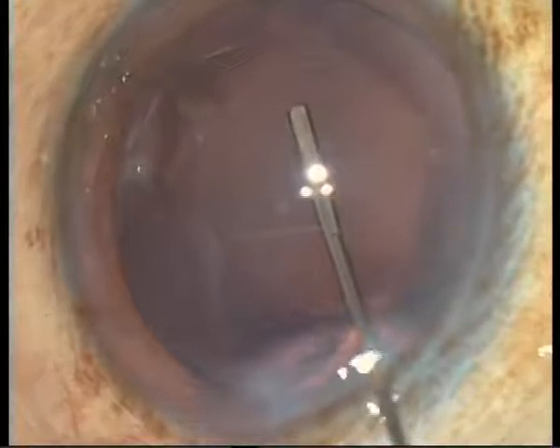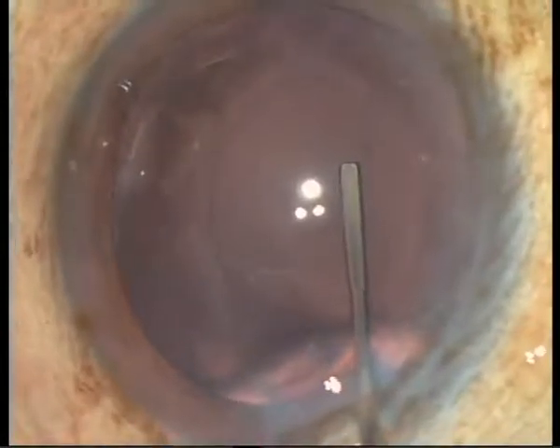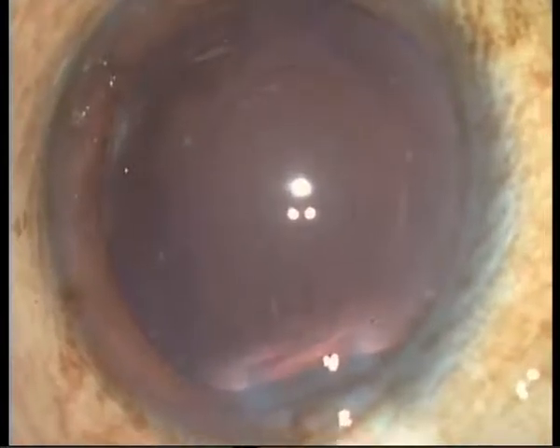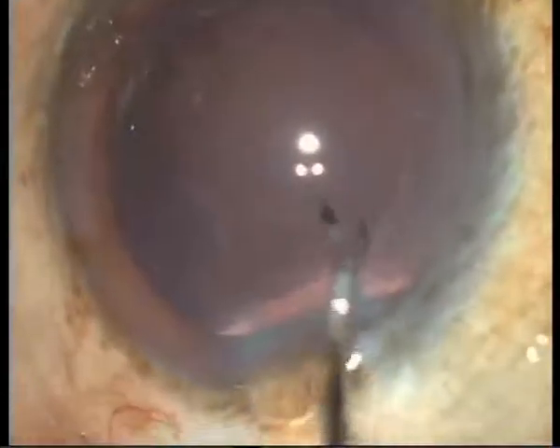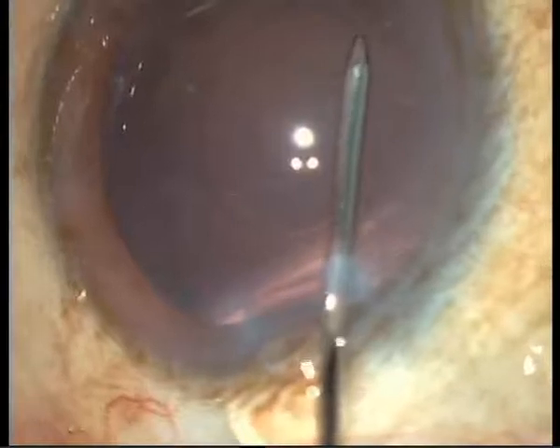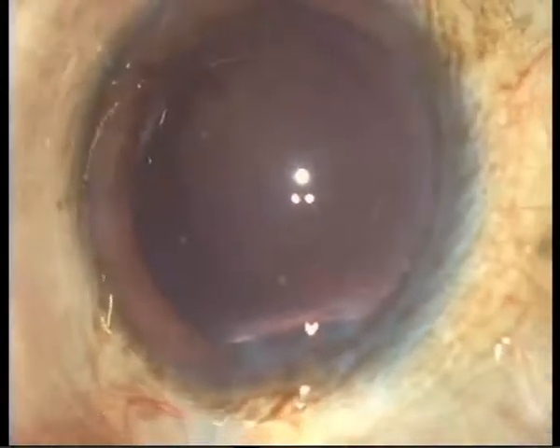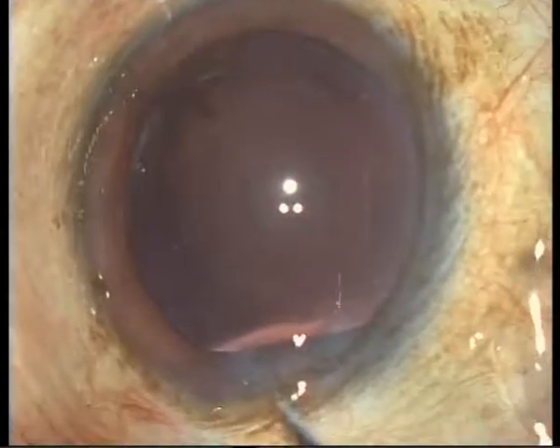Now injecting viscoelastic material in order to separate the anterior hyaloid from the posterior capsule. For those familiar with vitrectomies, you will see there are sometimes adhesions between the posterior capsule and the anterior hyaloid. This is an extremely interesting area — we want to better understand the anterior interface, as we already know a lot about the posterior interface and the vitreous face.